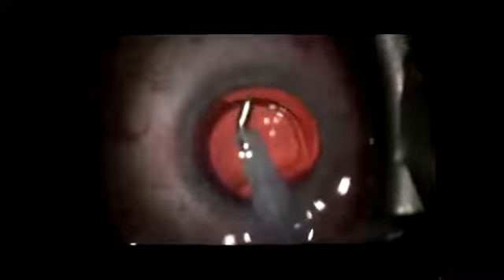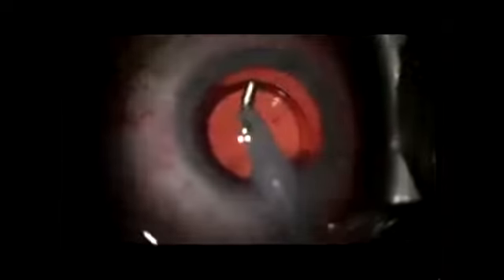This is done after the eye has been rotated back to the primary position and we're looking straight down at it. Irrigation aspiration now proceeds in the usual fashion. The small amount of blood that is there from the initial goniotomy is removed, and once the eye is pressurized, no further bleeding occurs as the blood rushes out of the canal of Schlemm. It is important to remove all the viscoelastic so we don't have an additional pressure spike.